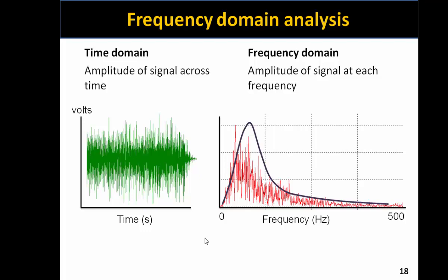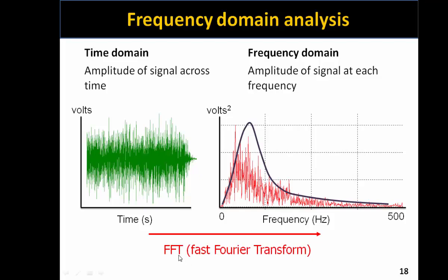So if we take an expression of the inherent frequencies and plot them, it will generate this very characteristic shape, a very positively skewed distribution. This mathematical process is called FFT, or a fast Fourier transformation, where a complex signal is decomposed into its constituent signals and expresses those signals based upon their individual frequencies.